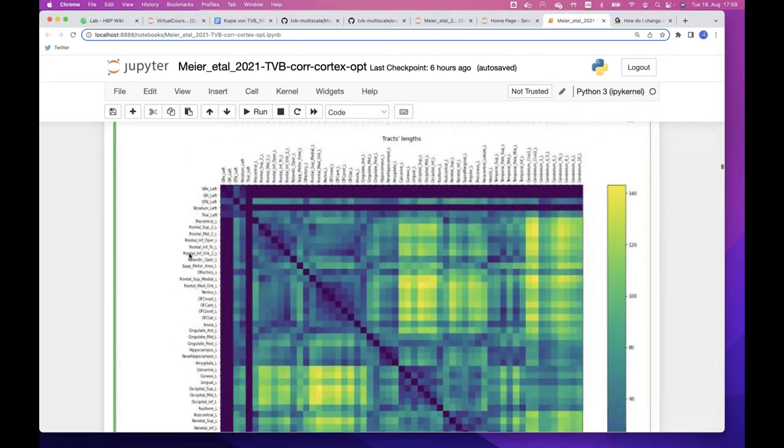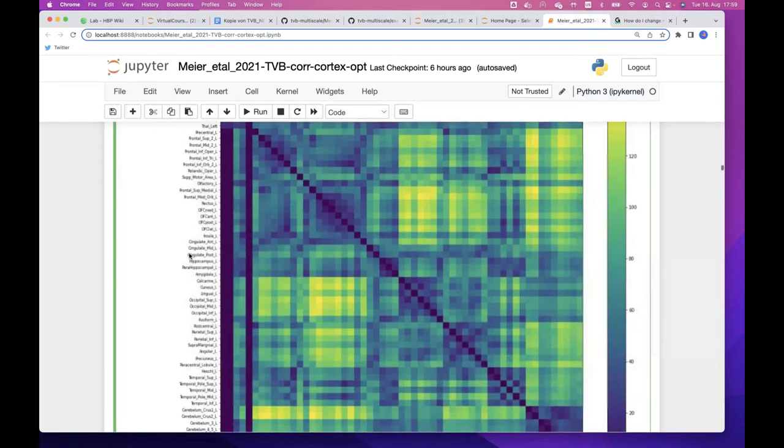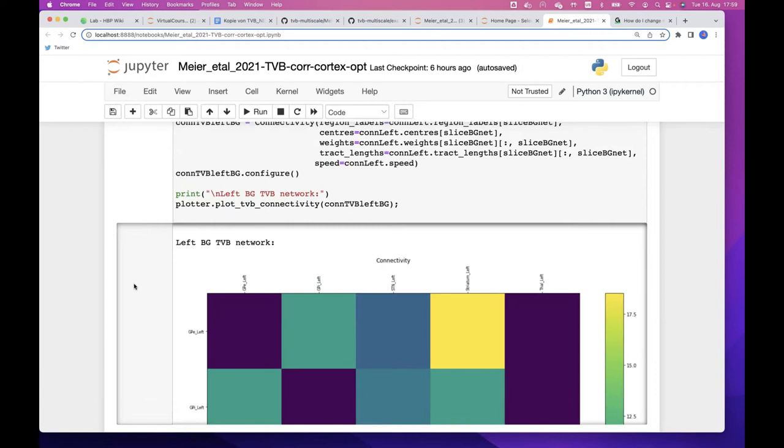And when it all comes together, it will look like this. Here you have GPe, GPi, STN, striatum, the thalamus, which are filled up with individual weights. And then you have the rest, which is filled with the Petersen connectome. And as I said already, the Petersen is going for all the basal ganglia connections towards cortical areas, and mostly frontal and motor. So you see, for example, the cerebellum has no play in here. It will be an isolated node. Nothing will be happening there because we don't have it connected in our network.